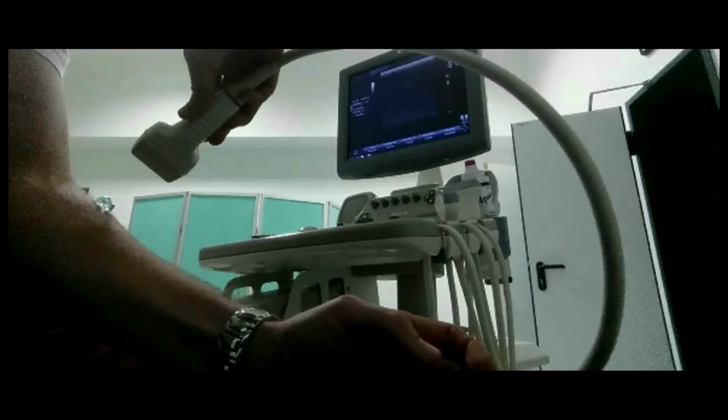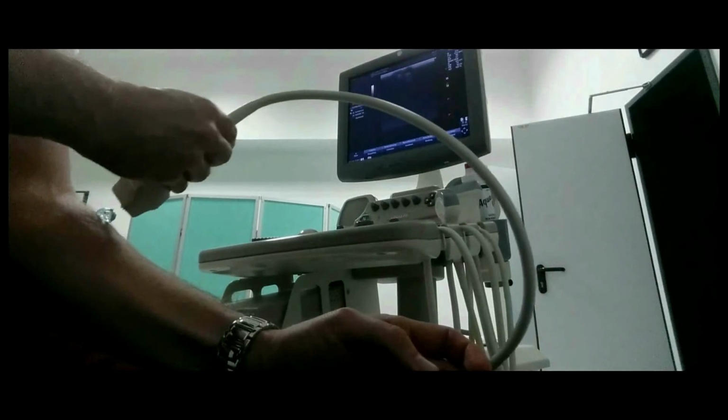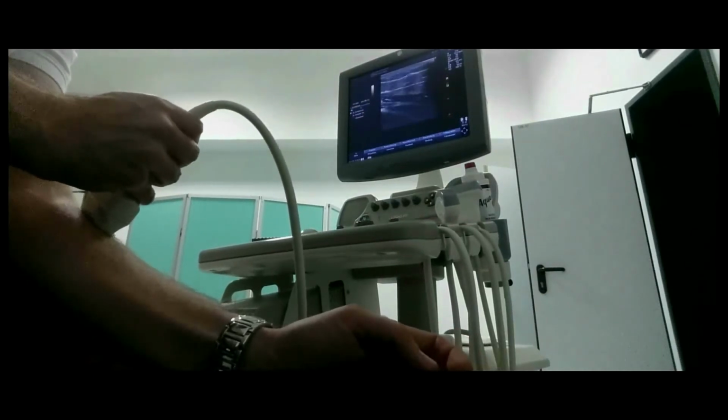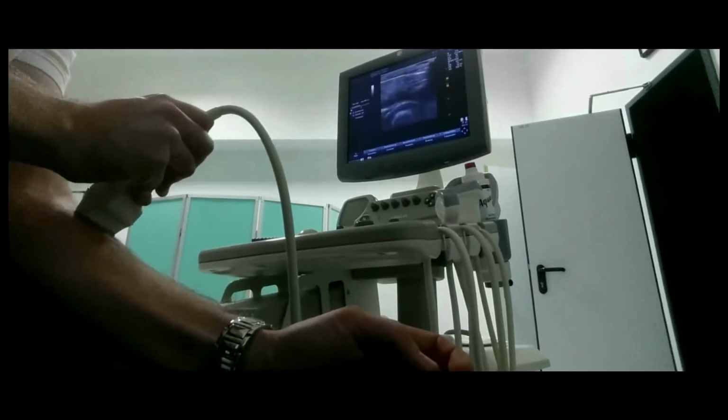So for this reason, the device is adjusted to a sound speed of 1500 meters per second, which is exactly suitable for the mentioned tissues. Only bones and air have absolutely different acoustic impedances and would scatter or reflect the sound waves, almost to total reflection. That is why we use the watery gel to bridge the air.